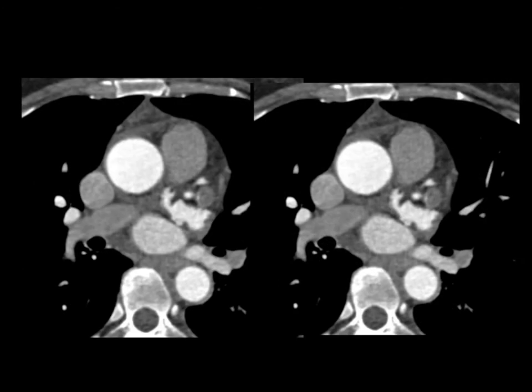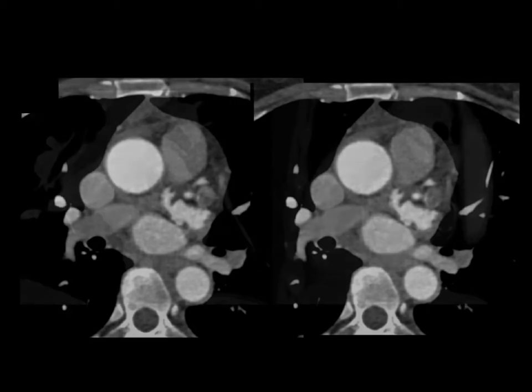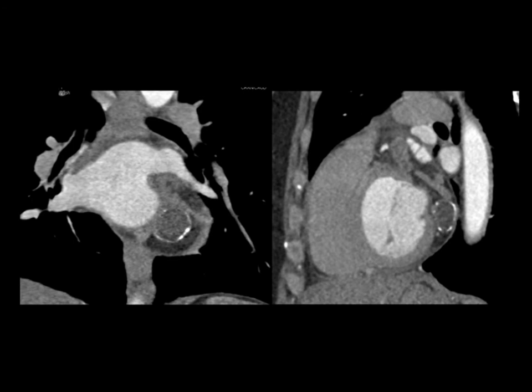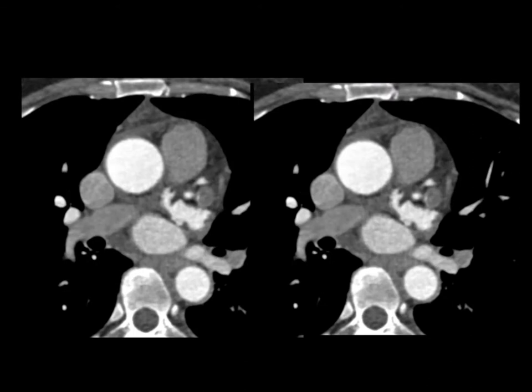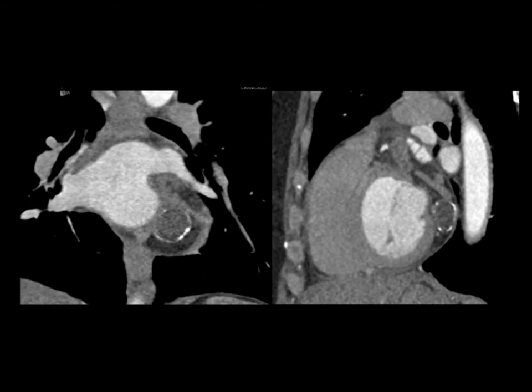Looking more carefully, there's a second circular structure about a centimeter in size right past the patient's circumflex. Moving from those images to the next set, it has rim-like calcification and is circular. What is this? What's the key finding beyond that coronary? It's not a fistula like the last case, it's not an anomalous coronary, and it's not stenosis per se. Yes, the patient does have occlusion of the circumflex — but the answer is a coronary artery aneurysm. Looking back at the same case, you can clearly see a circular structure with calcification. That's a coronary artery aneurysm.